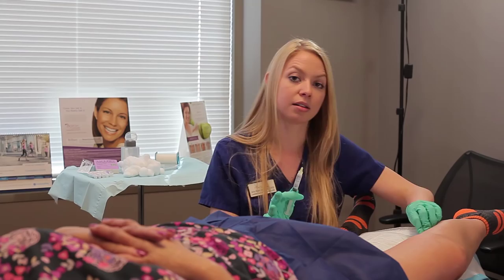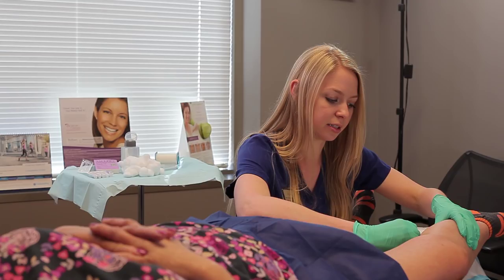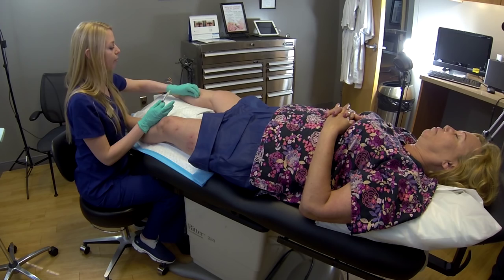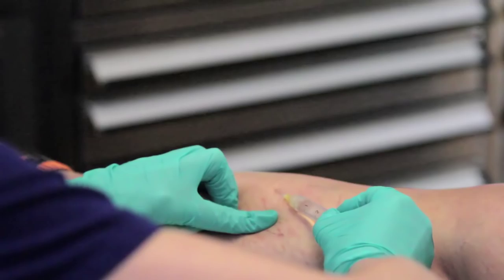At the end of five sessions you're looking at about an 80% reduction of spider veins in the area. Unfortunately some of them can be non-responsive. The ones that respond best are the ones that we're injecting here — they're more pronounced, a little bit more purpley-blue. The ones we typically find resistance on are very tiny thread-like red ones, which makes it very hard to get a needle tip into.